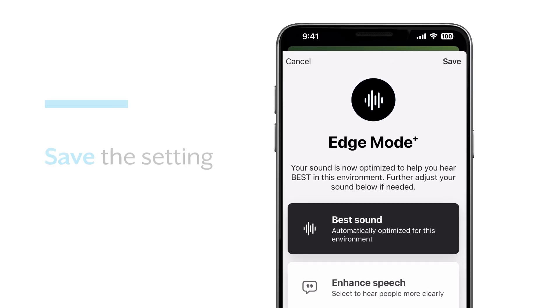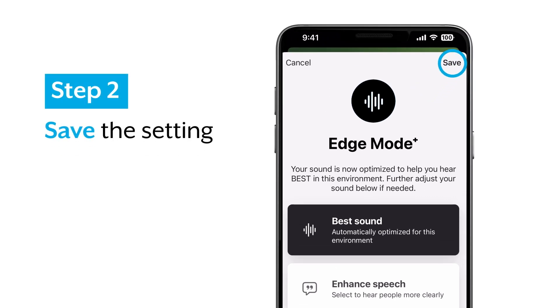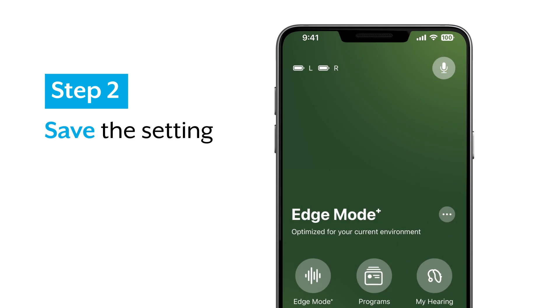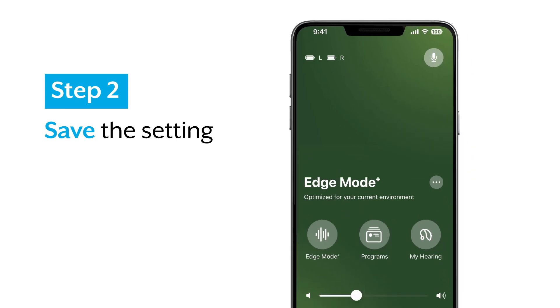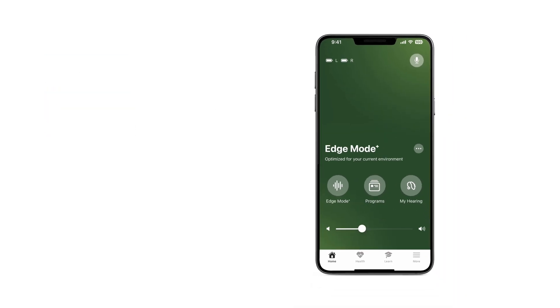That's it! Tap save and you'll return to your app home screen, where Edge Mode Plus shows as your program in use until you change to another one.